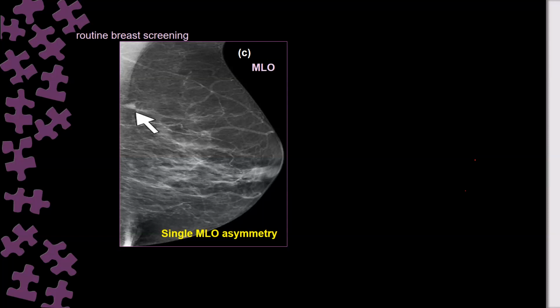At superior posterior, most likely it will be on the lateral breast. And there is one clue here, that the MLO is not even optimum. Can you tell me why it is not an optimum MLO?